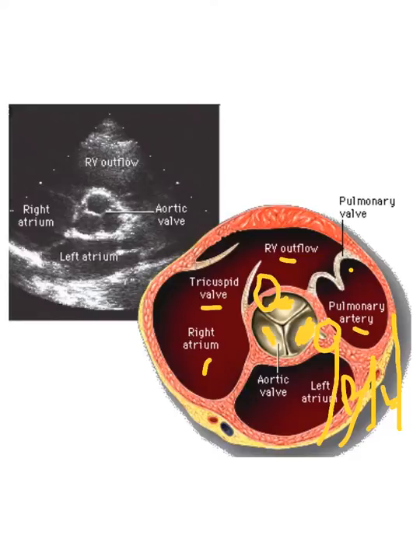So in some cases, they may want you to get coronary flow, or at least a good look at the coronaries. In children, there's a disease called Kawasaki's disease where you really need to look at the coronary arteries because they can become aneurysmal. In adults, it's not quite as important, but there are people doing studies regarding coronary flow via echo, but the velocities are kind of off because you're not very parallel to flow. So they're trying to work on that to see if, if there's a blockage, they could pick up the difference in Doppler signals. Maybe with any luck they'll figure it out, and it'll be good.